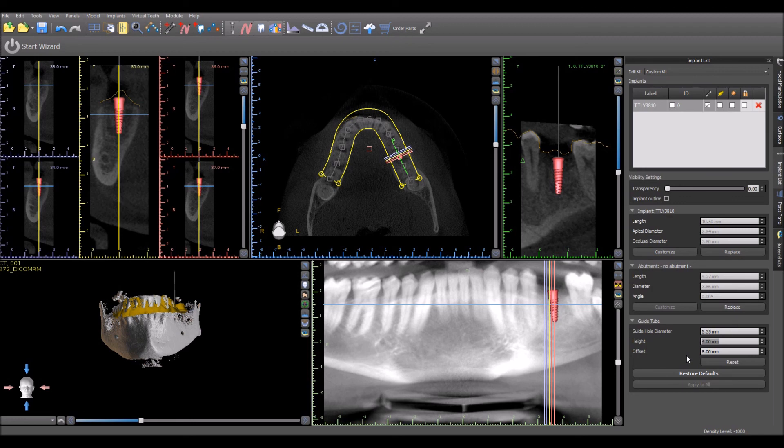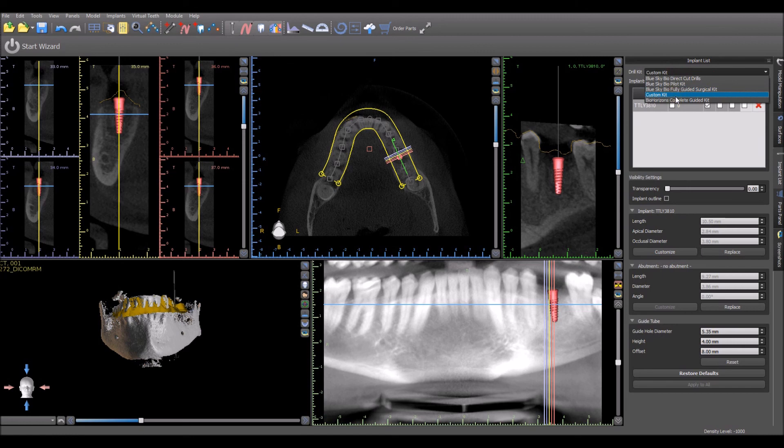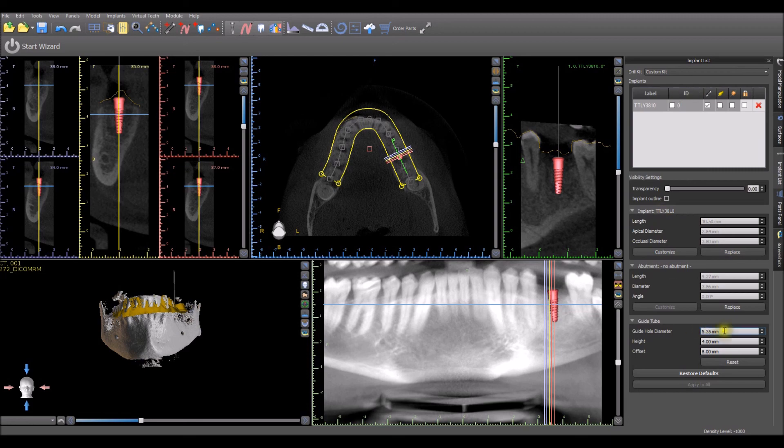Next time you use the same implant and switch to custom kit, the software will automatically bring up the previously entered settings for the specific implant.